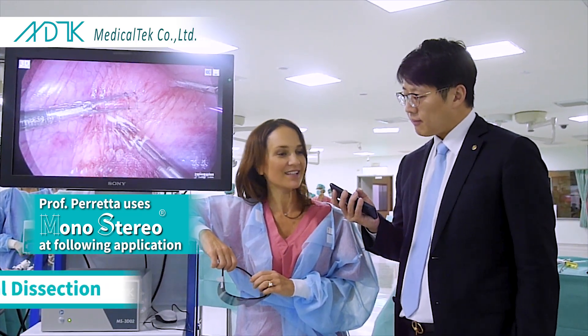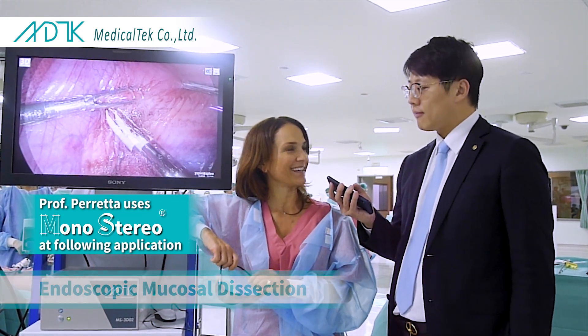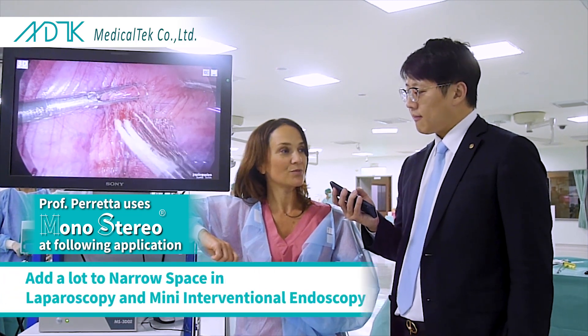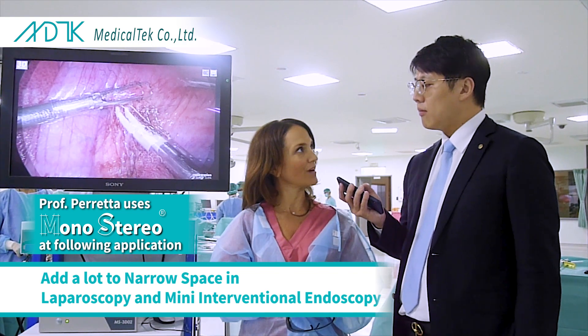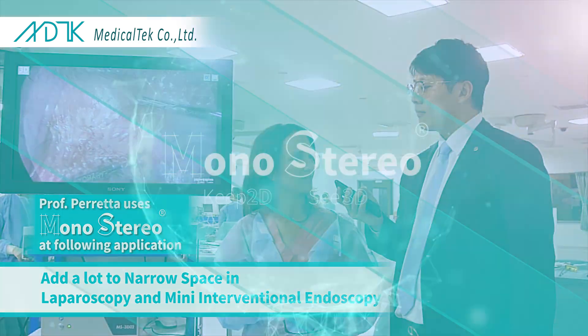I would be very excited to try some endoscopic submucosal dissection, and I think that is really something new. I do believe that in narrow spaces it can add a lot to the way we work, both in laparoscopy and in interventional endoscopy.